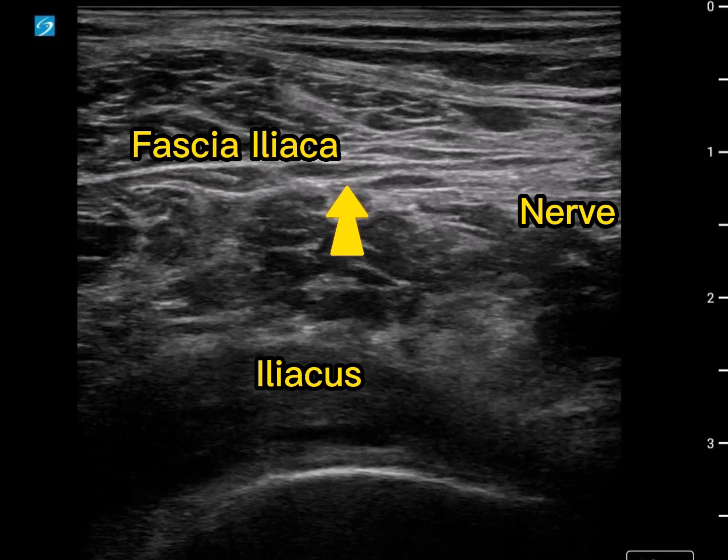First thing I want to highlight is just how heterogeneous everything looks. We've got the iliacus muscle inferiorly, and quite a lot of inclusions, lots of little bits of gray and things, and that makes the differentiation between the fascia - the fascia iliaca - and neural tissue even more difficult. Just one of the realities of an actual nerve block.